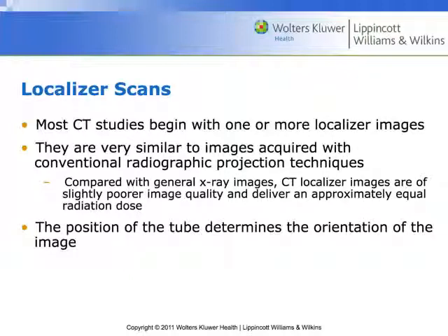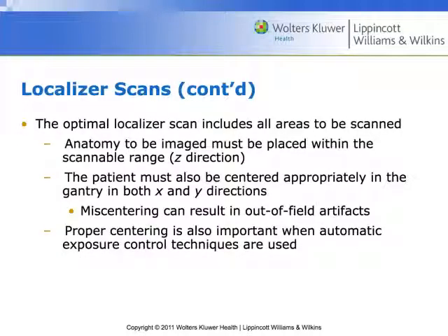Okay? So if we were to break CT scanning down to 3 steps, it would be data acquisition, image reconstruction, and image display. So far we've talked about image display and image reconstruction. Now today we're just focusing on that data acquisition phase.